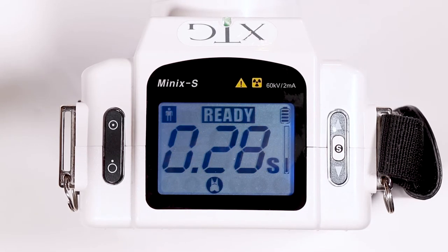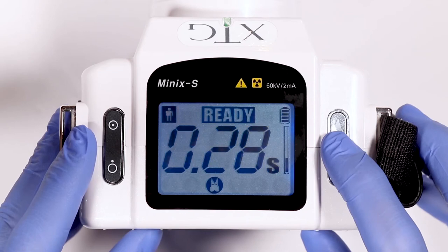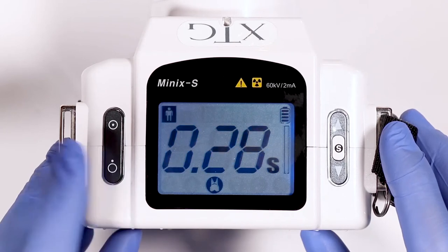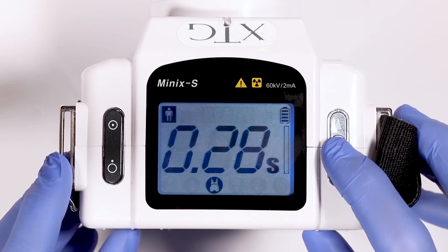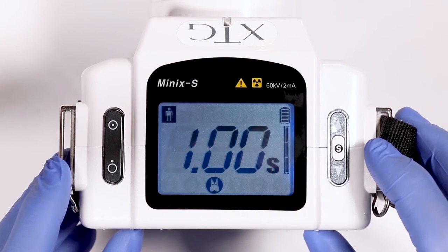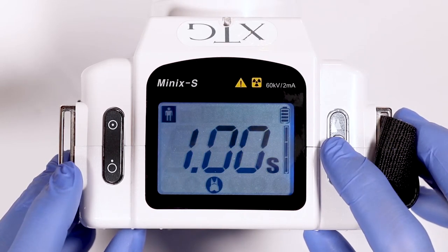To change from digital X-ray sensor to phosphor plate or film, press and hold the S button. Press the power off button 2 times and you will see the bar flash. Touch the S button and 2 bars will show. This is the phosphor plate mode. Touch the S button again, and it will show 3 bars. 3 bars is your film mode.